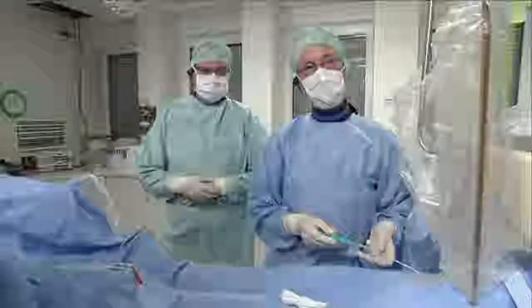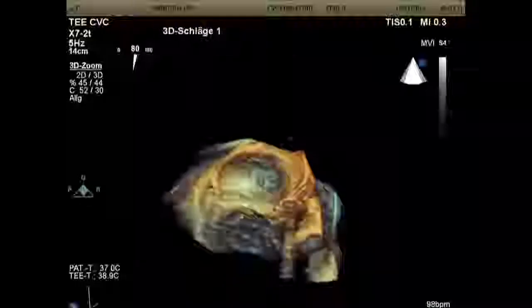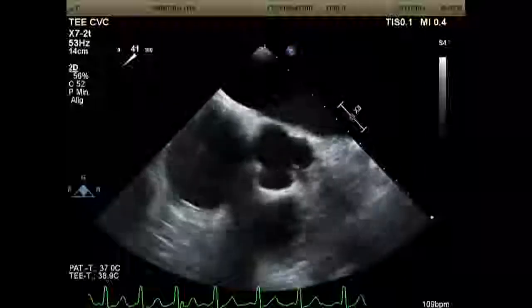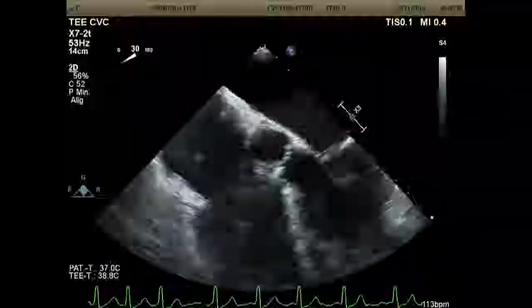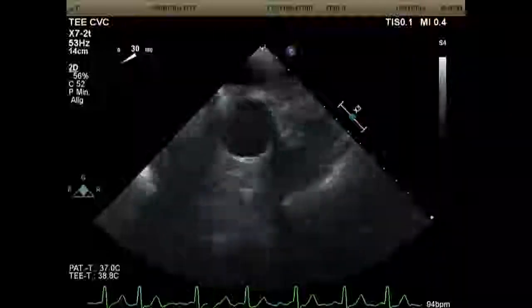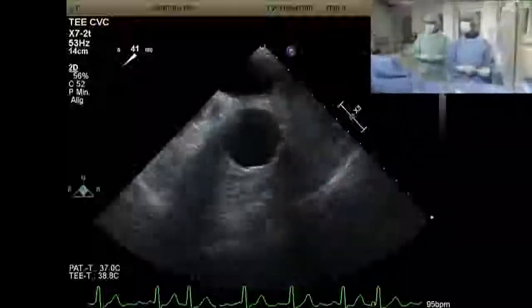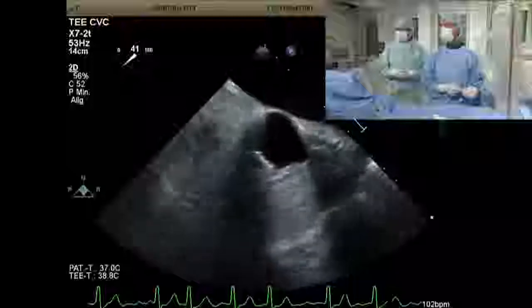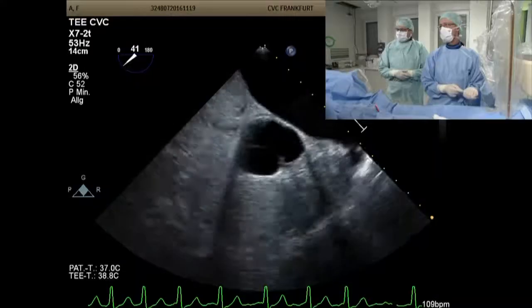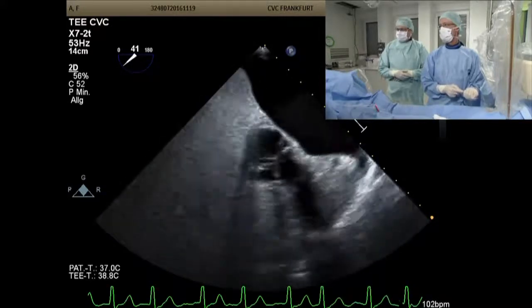So, Bushra and Bojan, can you give me a short axis of the septum and the aorta? I would like to start with the bubble test. The reason is that if there is a PFO, then I may consider using the PFO instead of doing a transeptal puncture. The best way to rule out any intra-atrial shunting is short axis, 30 or 40 degrees, and then just focusing on the aorta, because if there's any shunt, then you will see bubbles appearing in the aorta. So it looks like there is no shunt.